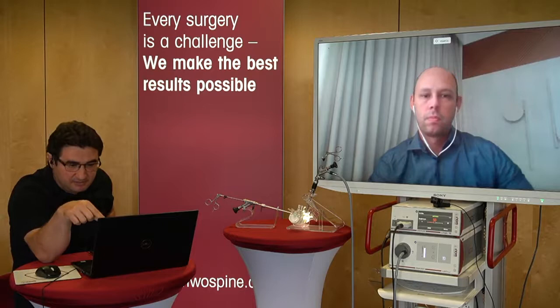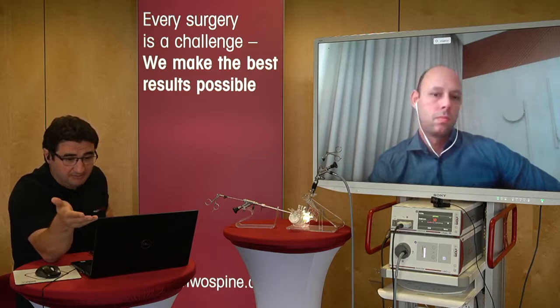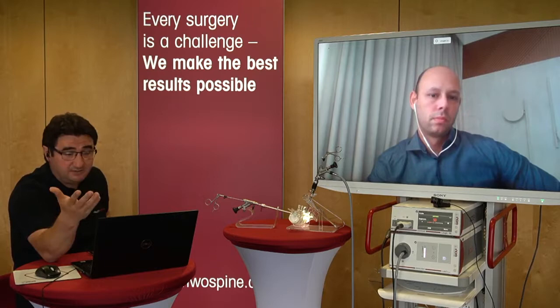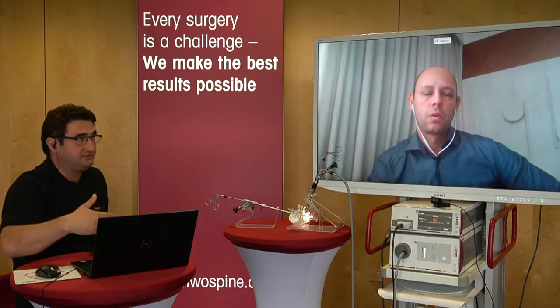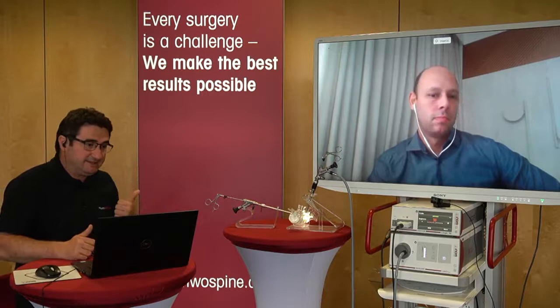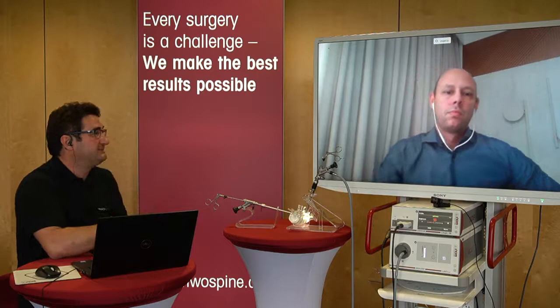Maybe Dr. Tandon would like to ask about transforaminal optic or interlaminar optic. Of course, you can do the interlaminar approach with the transforaminal optic, the transforaminal system. But using longer instruments for the interlaminar approach is not very comfortable for the surgeon. You have to take more steps. Another problem with the longer optic is that while you are using the instrument for the lateral part, you can bend more and you can easily break the endoscope with this technique. Then it's better to use the interlaminar optic for the interlaminar approach, in my opinion.